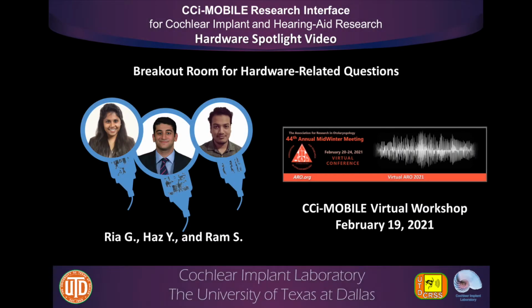To find more on how each of the components of the platform works, or how to visualize the electric output, join me in the hardware breakout room at the end of this workshop.